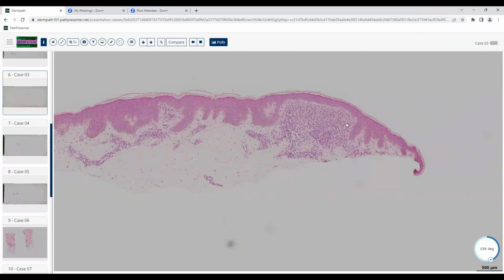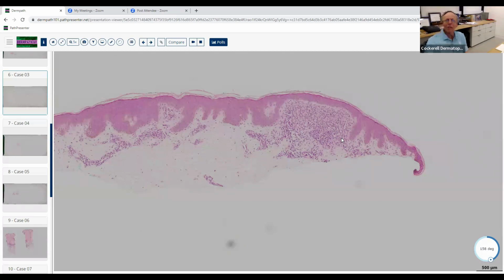What else might they choose? What if they put tuberculosis down there? Well, that's possible, but it wouldn't be the best answer. Right. Best. That usually doesn't give you a sarcoidal-like granuloma. It usually gives you more of a caseating granulomatous inflammation. So that wouldn't be the best one.